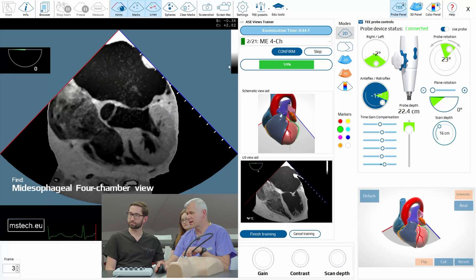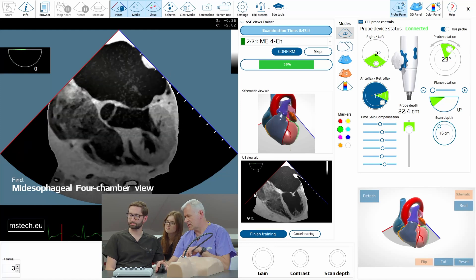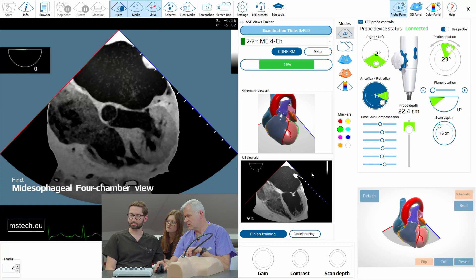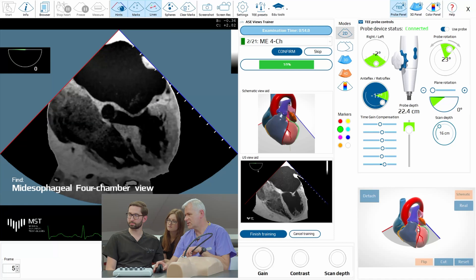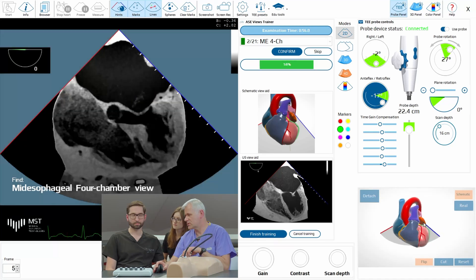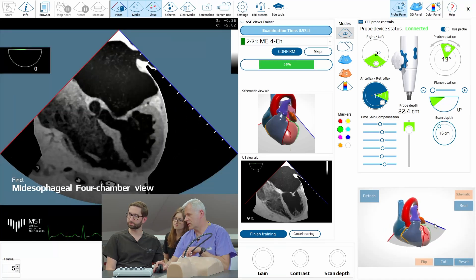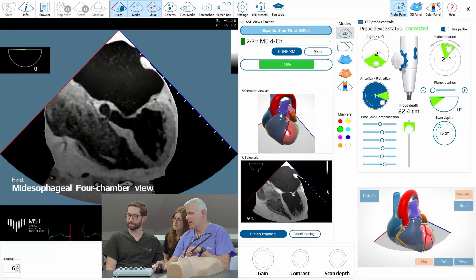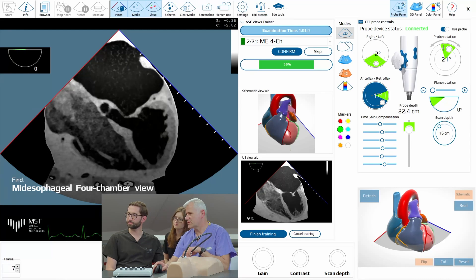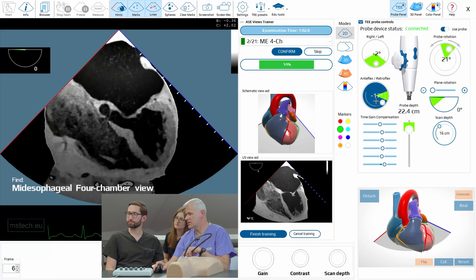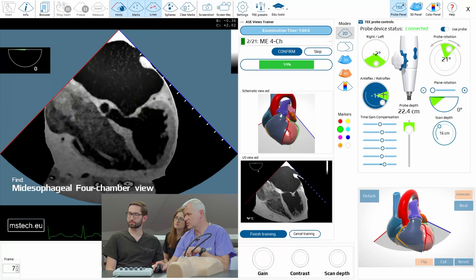Now we go to the next view, which is the four-chamber view. Here is the view you are going to achieve, here is the plane showing you how the heart is cut, and this is your current plane. If I move, you see it's moving live. Moreover, you have suggestions here — if you are really lost, you may use them to adjust the planes and get the best possible image.